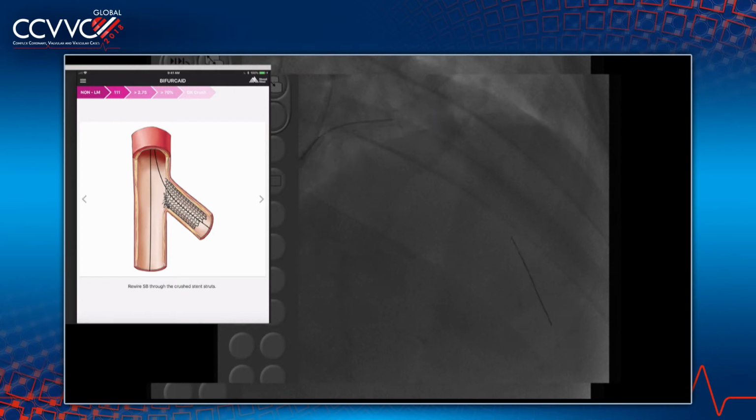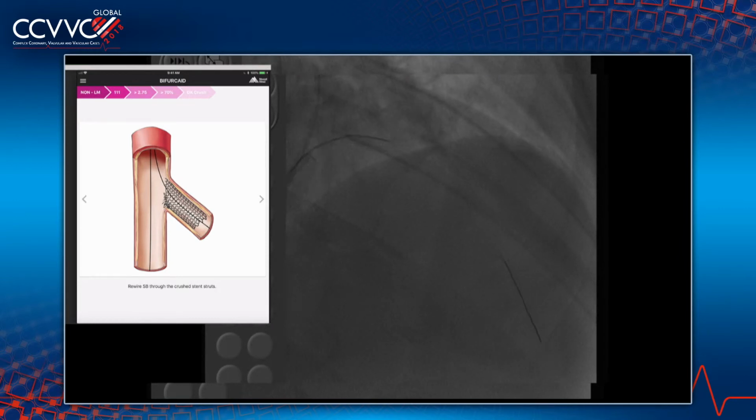Usually I've seen them go just distal and proximal, and come back. Whenever it goes, it goes. You cannot be too selective here. I always try, and not always achieve. But remember, the DK Crush people say go to the proximal strut. Otherwise, with the bifurcation teaching, it is go to the distal strut. When the angulation is bad, sometimes I leave the wire and then open a third one to help to guide. But this should be fine.